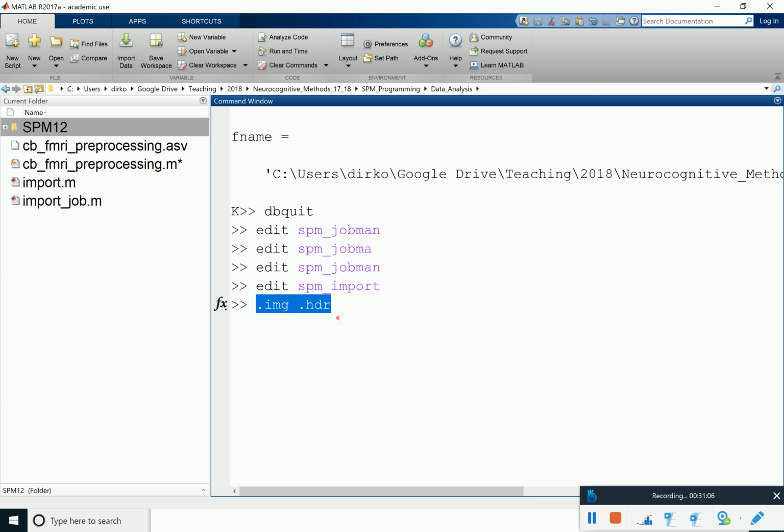What has come true is that there are 4D files which we now create, which are also the Nifty files that you create under batch. They are 4D files, meaning that the volumes are put together into one file, but then to actually analyze them, you still have to split them again. And image header would, when we do the splitting, which we haven't done yet, instead of using Nifty, use the image header format. I think it might be an option in the import, but I'm not sure.